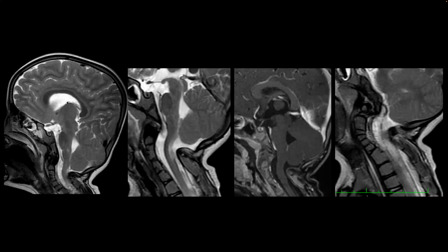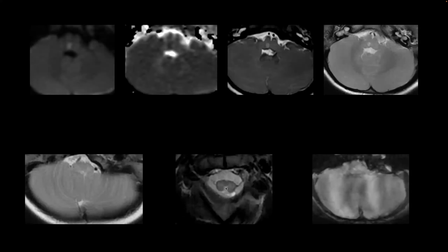This one over here is just a tiny infarct, isn't it? Yes. But if you see on the T1, it is not the CSF. You can see the cord is intact there, and that corresponds with this area, the non-enhancing component. I'm still confused. On the axial over here, the medulla is edematous in the ventral aspect and the lateral portions.